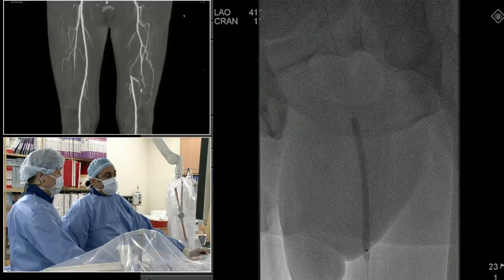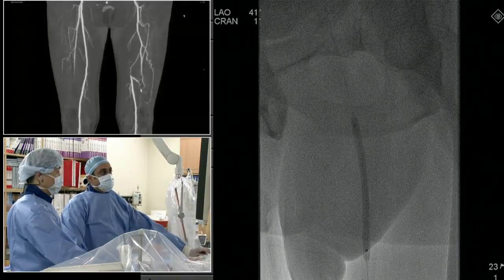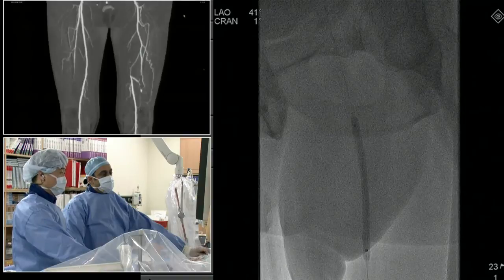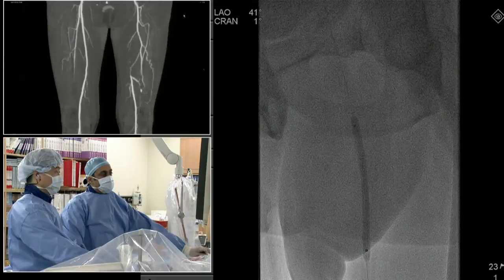I think that's a good question, Michael. I think that for us, the outflow is critical, just because that's where most of this, you could see the difficulty of how it looked. The middle, I think, is just a deep wall cut. I think you were more adventitial there, but I think that the outcome would probably be safe there. But again, very limited data to support that. I would tend to lean towards a drug-coated balloon at the origin as well as the exit just to hedge my bets, but it does increase your overall costs. I think you can still do a plain balloon for POBA upstream as well, because I think that entry seemed to be relatively preserved. But I think there are a whole series.